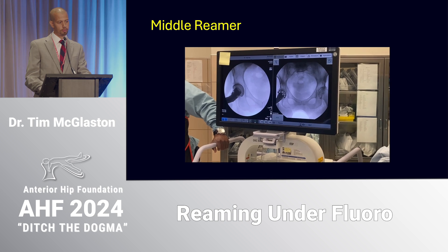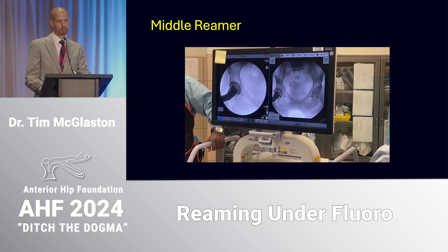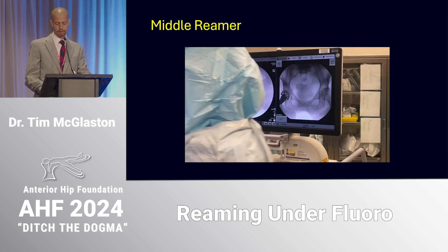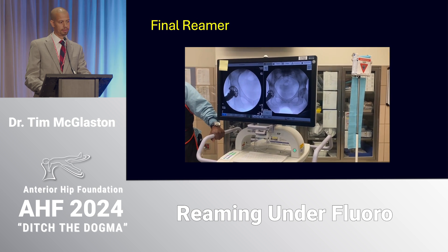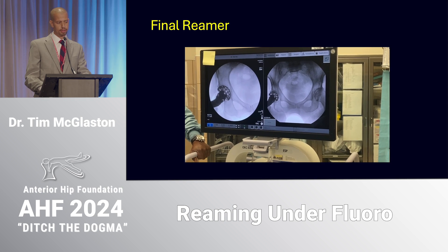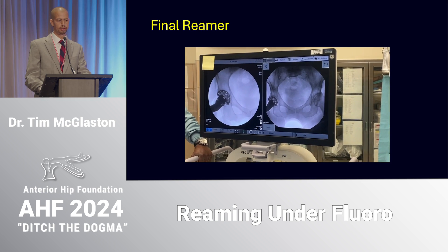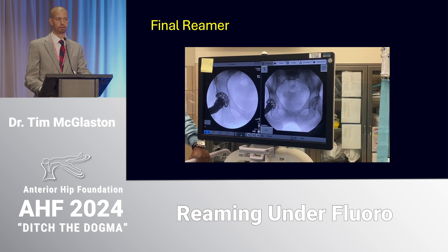With the middle reamer, again this is more to engage the rim and periphery than to further medialize. For the final reamer — a style point on softer bone when you're concerned about blowing through the medial wall — I squeeze and release the trigger as I apply pressure, check a fluoro shot after maybe a second or two of squeeze-and-release, and that helps prevent over-reaming or over-medializing through softer osteoporotic bone.